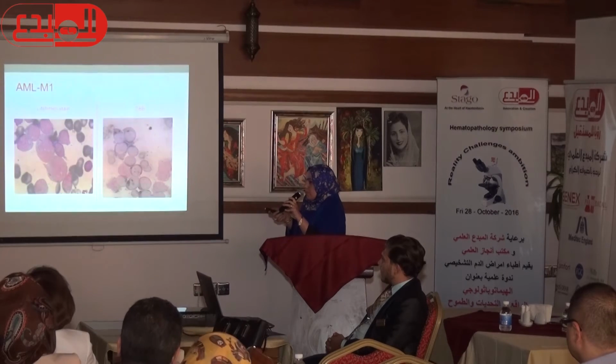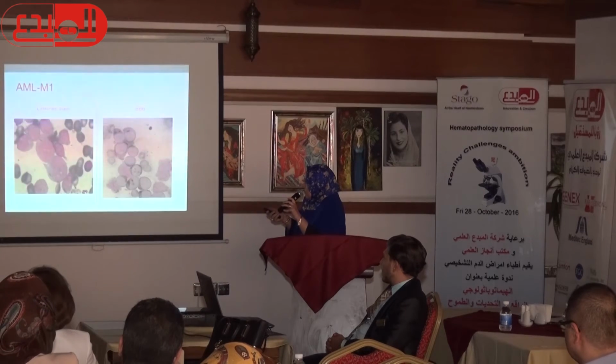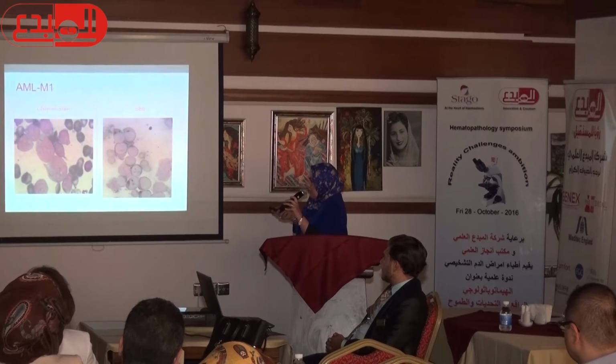This is our job in our hospital. As you see, the Sudan black makes Auer rods more prominent. These are Auer rods, but they look more prominent when stained with Sudan black.